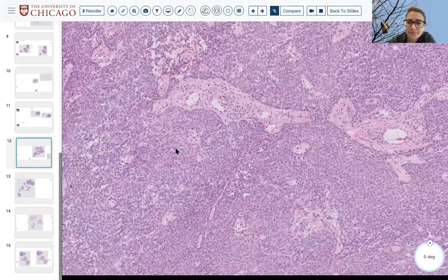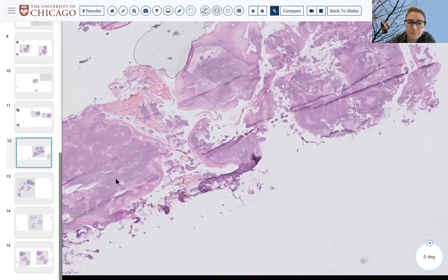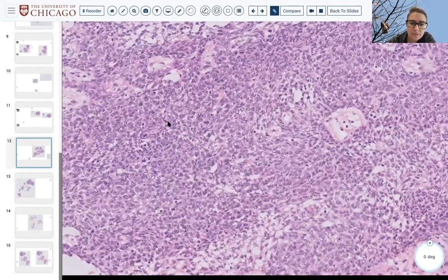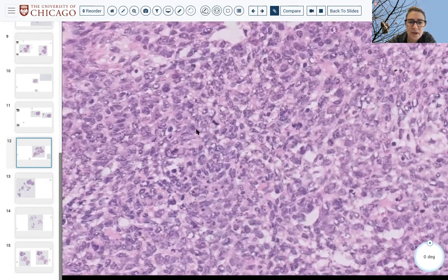Yeah, and I would agree. I think usually non-keratinizing SCC tends to be a little more basaloid in my, I guess, limited experience. So this is what it sort of reminded me of. I mean, this is definitely carcinoma. There's a huge mitosis there. Yep. Just to echo. Excellent. So yeah, you guys are right. So if you got to carcinoma, excellent. That's all they need to know on frozen. This is carcinoma. You got it.